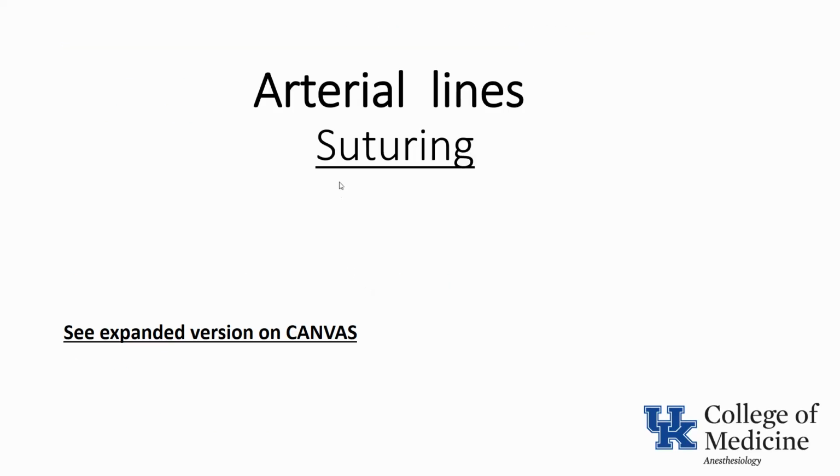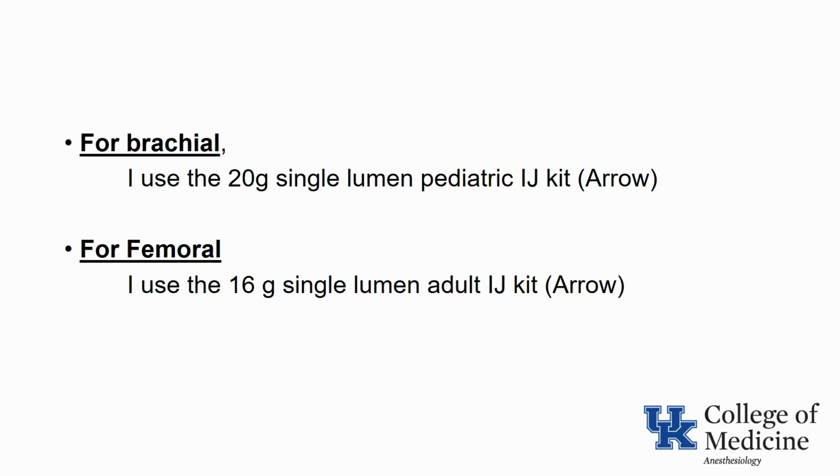I've also described in detail how I recommend suturing arterial lines. I recommend always suturing, even if they're only going to be there for a short time, to minimize the risk of losing it, but not everyone agrees with me. Again, I've described this in great detail on Canvas if you are interested in reading about it.